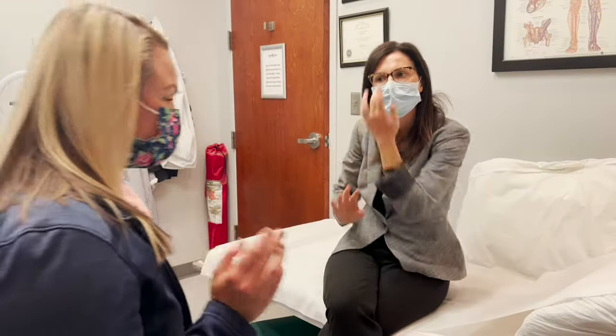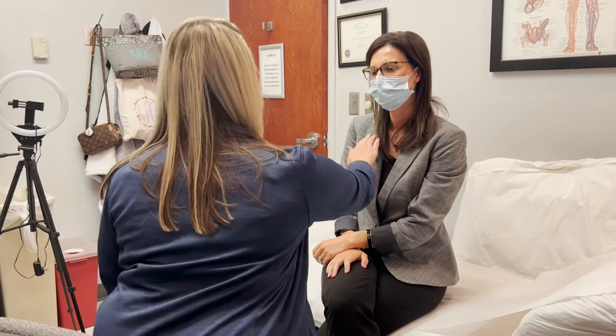Okay. So today we're going to do an echo on you. I'm going to put three stickers, one right here, one right here, and one right here. I'm going to hook you up to this machine. It's going to produce an EKG while I'm doing your echo.